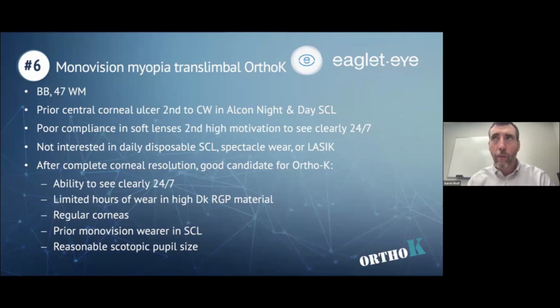Well, where does that play in with orthokeratology? They don't want surgery, they don't want to wear glasses, and they don't want to ever see blurry. There are generally only three main options there: wearing your contacts inappropriately, surgery, and then that third option, which is orthokeratology. OrthoK is actually a great option for somebody who wants to see clearly all the time, and you do see clearly through the lens as well as when you take the lens out. So sometimes these non-compliant soft contact lens patients might not be bad candidates for OrthoK. They might sometimes be some of the best candidates for OrthoK.